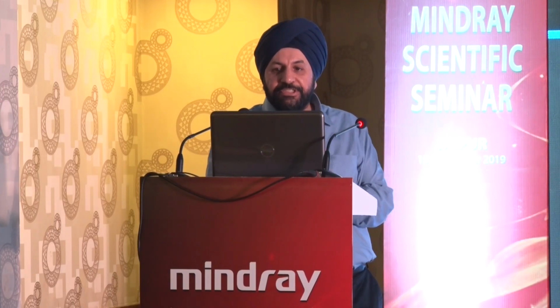Our IPF normal range is up to 7%, but again a caveat, every lab must compute their own IPF because different manufacturers, different reagents, it's a calculated parameter, different algorithm also. Even within the same manufacturer, if you are using 2 different instruments, it could have a slightly different biological reference.